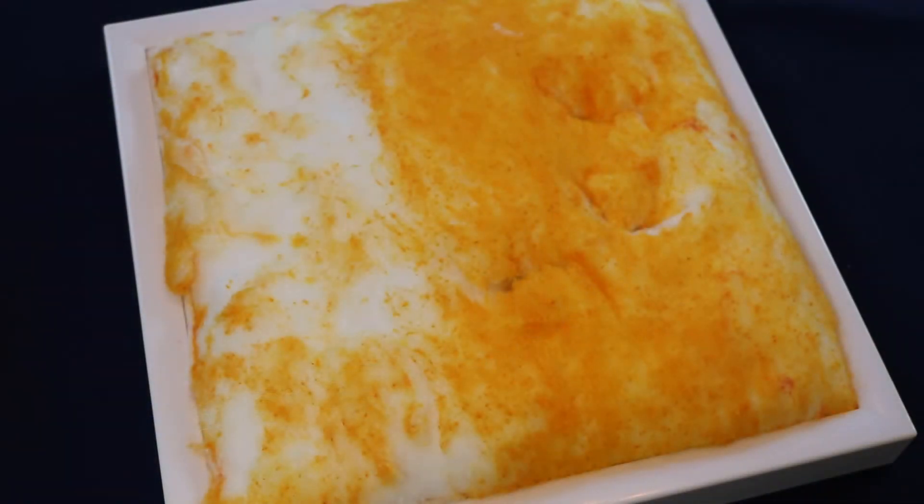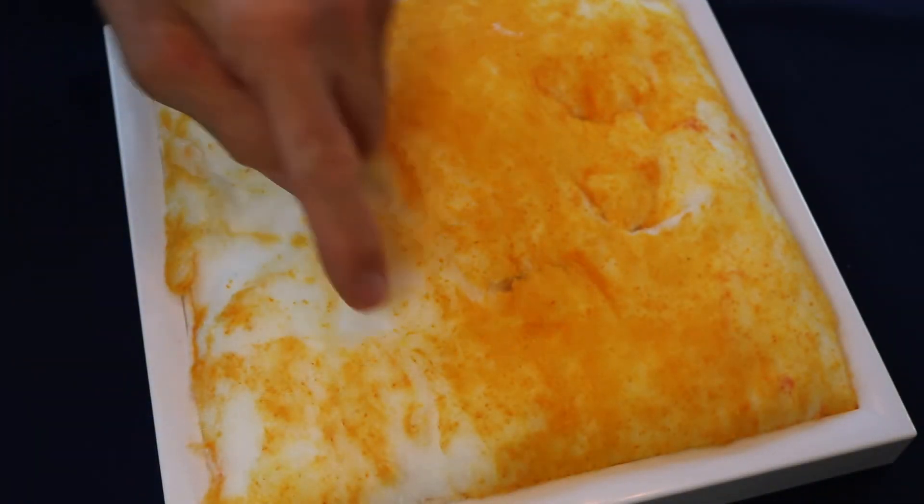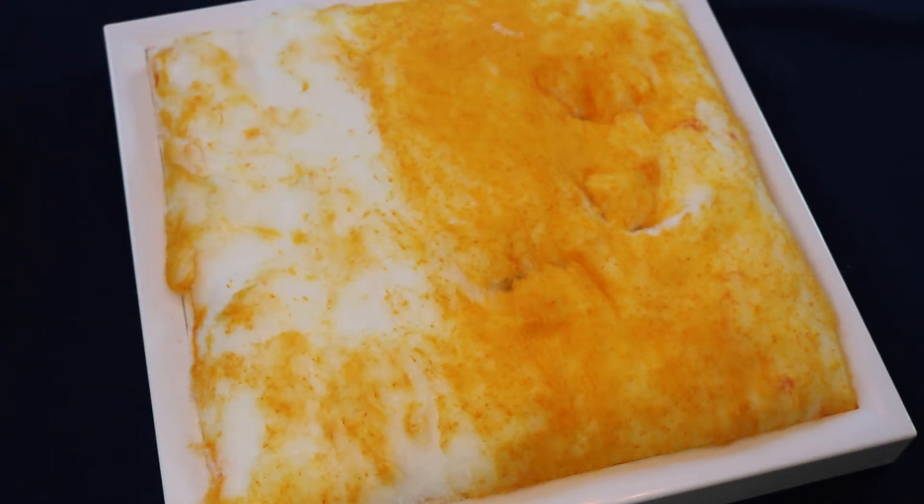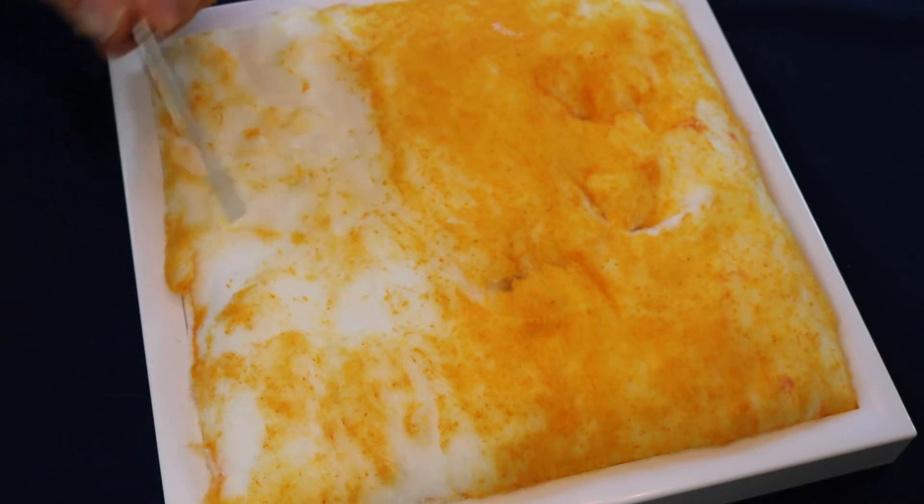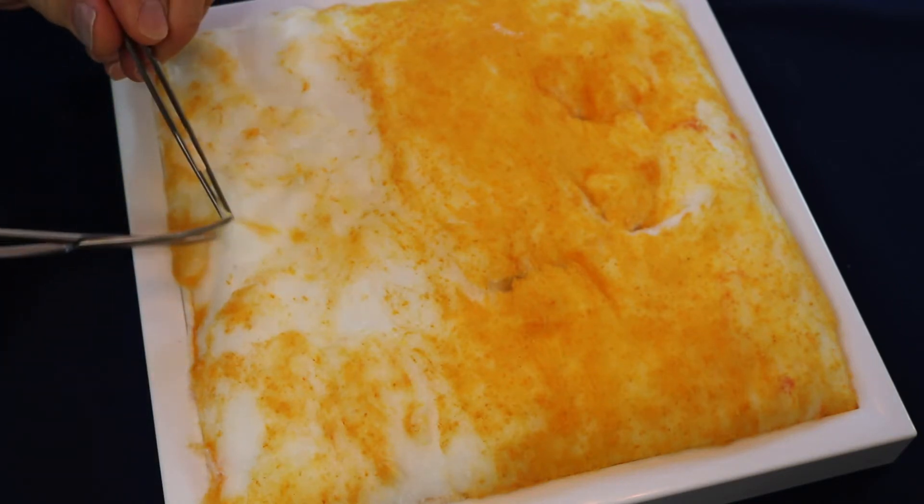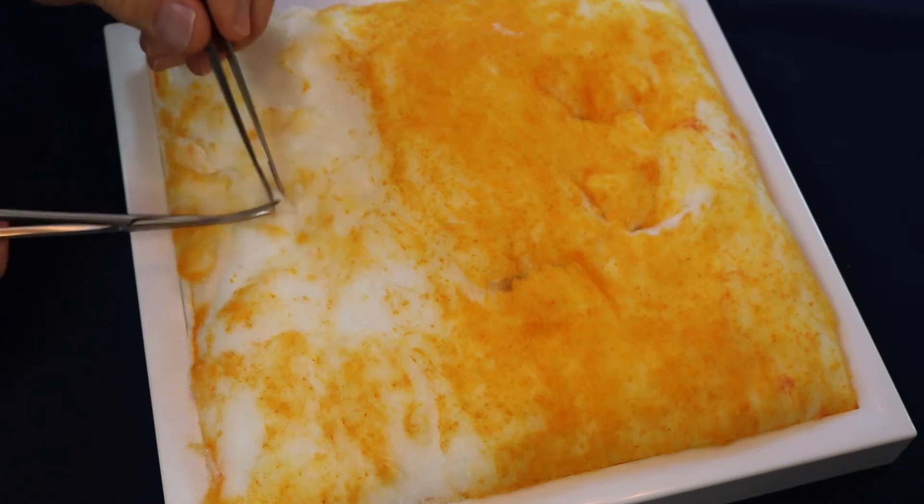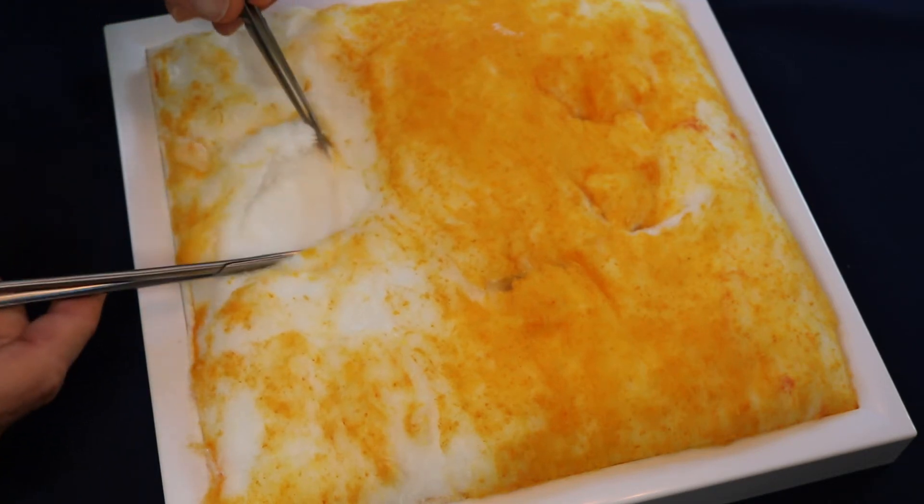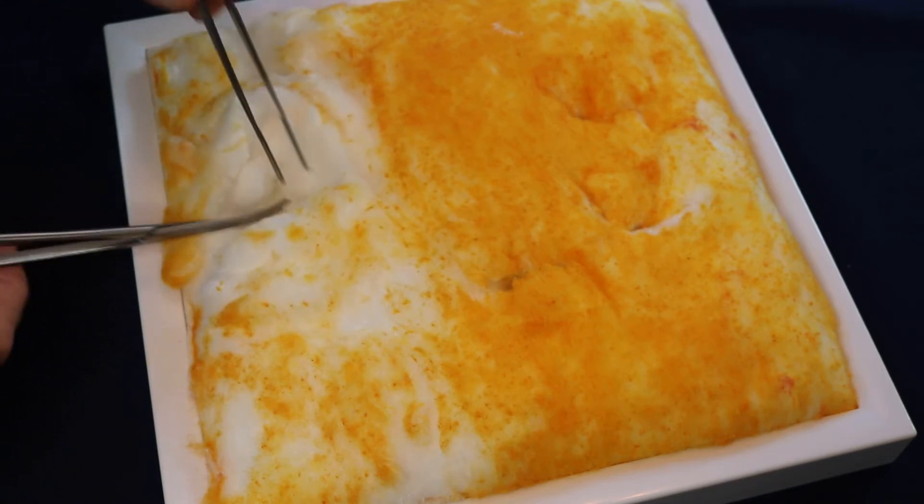Once all of the masses have been excised, proceed to the removal of the two simulated veins. First of all, you have to find them, and this is probably best done with a vertical exploratory incision over the middle of the lower board. As you dissect down, you will see the blue structures buried deep within the simulated fat. Very carefully expose the upper surface of the vein.